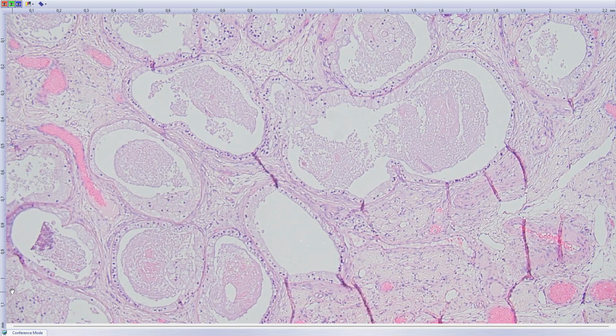In general, metastatic tumors of the testis are very rare, but when we have metastatic carcinoma, in most cases it is from prostate, and it is close to rete testis. So sometimes it can resemble rete testis adenocarcinoma, which is also a very rare lesion, and furthermore it is a diagnosis of exclusion. So before you make a diagnosis of rete testis adenocarcinoma, it's always a good way to first exclude metastasis of the prostate. And that's all from my side.